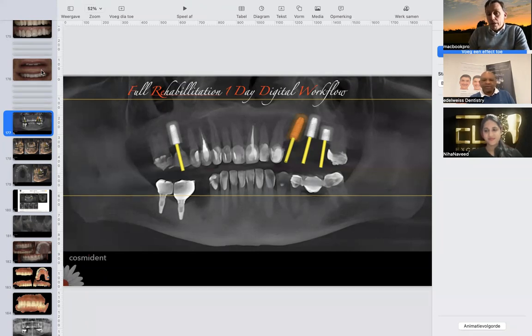Well, I think, Daisy, you want to ask me how we go about it if you augment the bite. Like I told you before, there are two ways that you can do it. The first way is the Michigan splint, which you can use to train the patient's muscles to the height that you want.